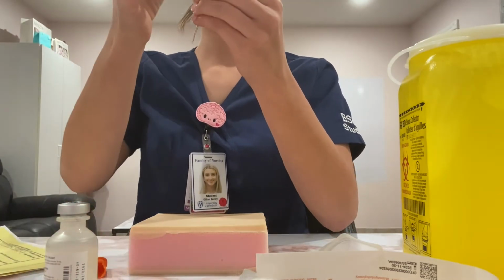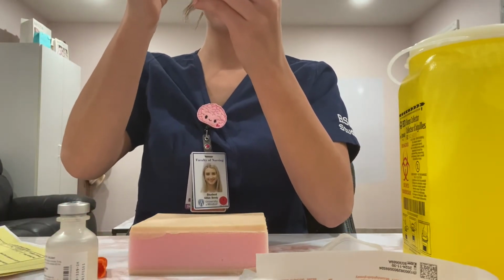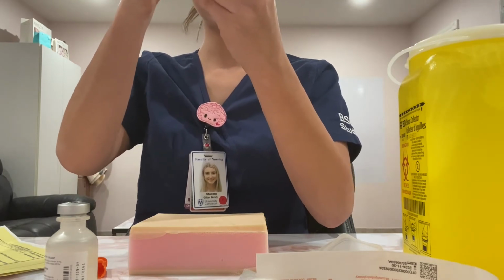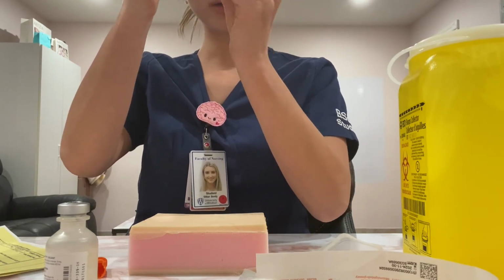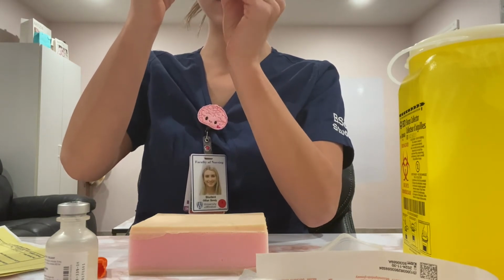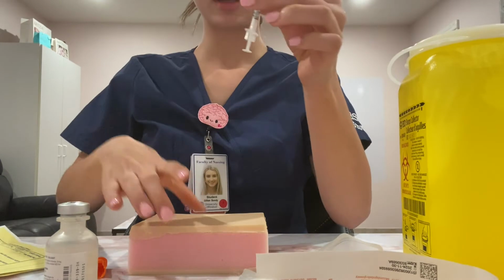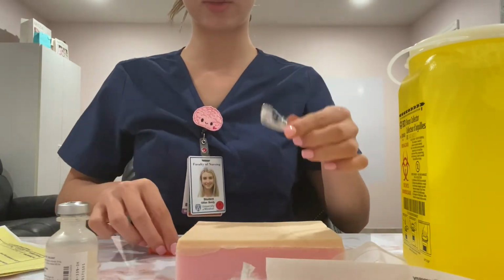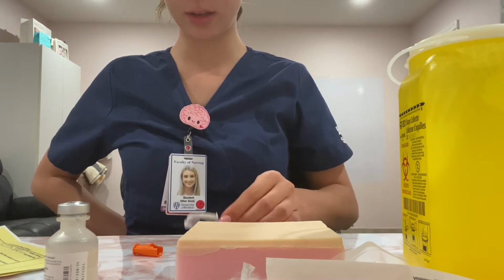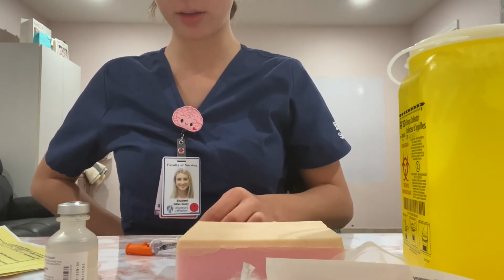Then I'm going to flick for any bubbles and check all the way around. Then using safe one-handed technique, I'm going to pull back.